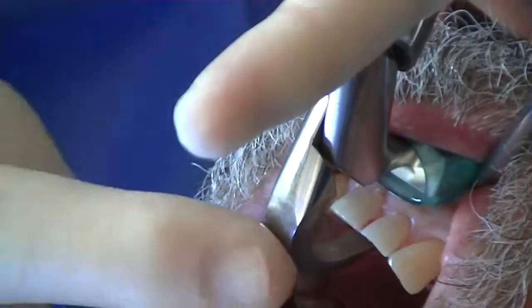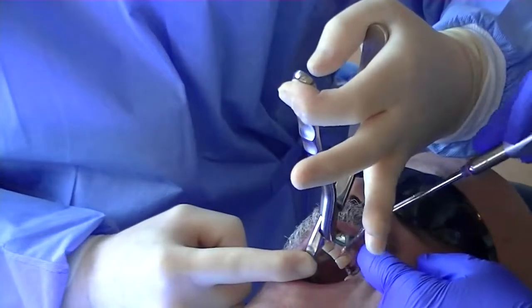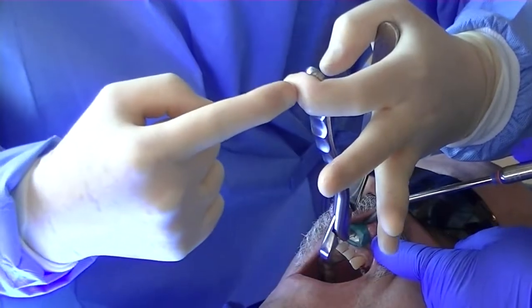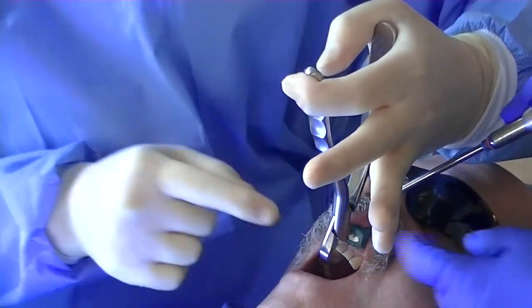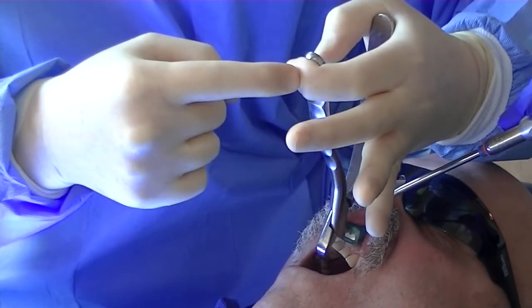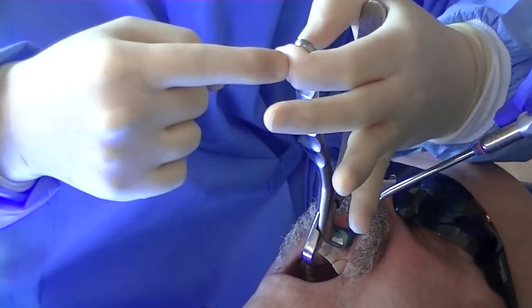And I can hold it with one finger, and if you retract back, you can see I'm really not squeezing the instrument at all. So my positioning is really just elevating towards the nose. And I'm putting tension with one finger.